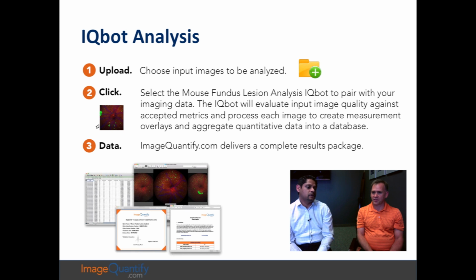Got it. It becomes a little easier with the detection because there's no macula in these animals. Humans have a macula, so the center of your eye is actually the macula. In this case, the center of the eye is the optic nerve. Is the optic nerve. Got it.